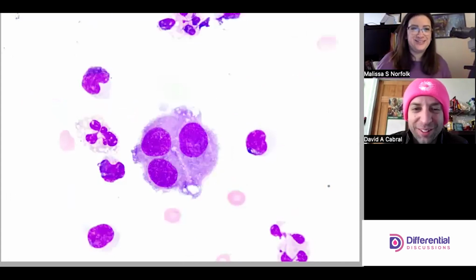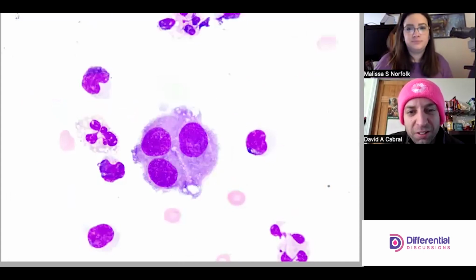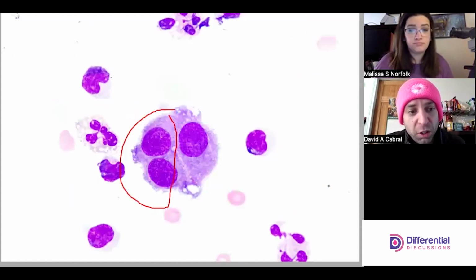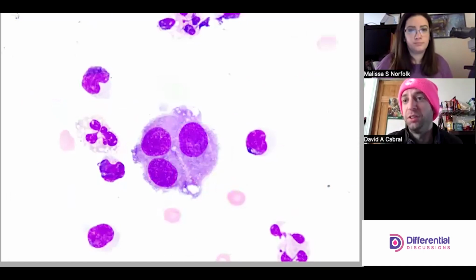Ah, wonderful. Gorgeous. So we got a nice, good, healthy window. And this may be a binucleate, which is totally cool for mesothelials, or it could be just three distinct cells, but just a perfect example of what normal mesothelial tissue should look like.